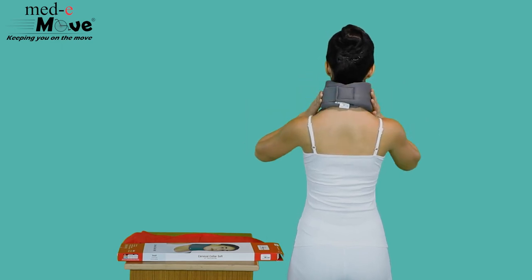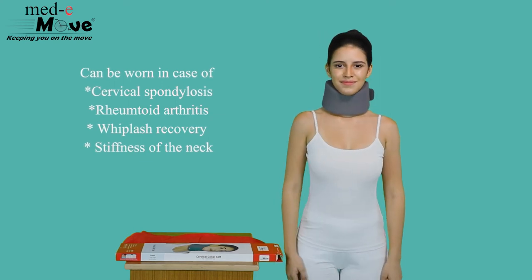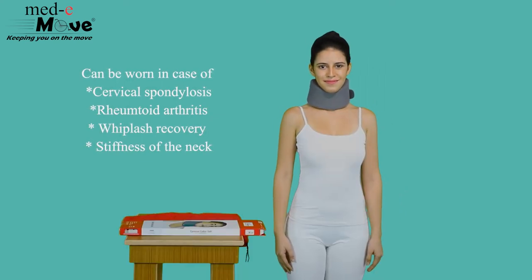The Medimove Cervical Collar Soft can be worn in case of cervical spondylosis, rheumatoid arthritis, whiplash recovery, and stiffness of the neck.